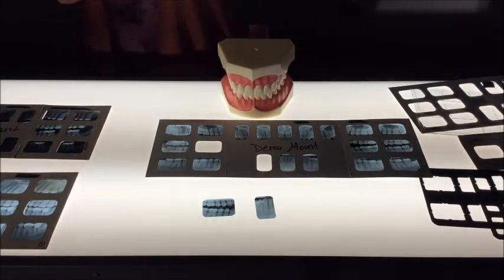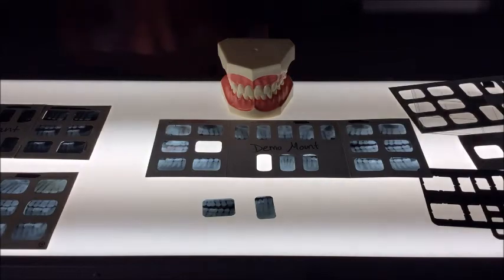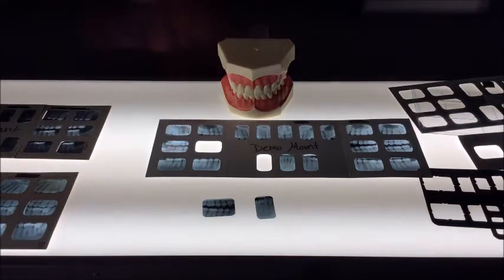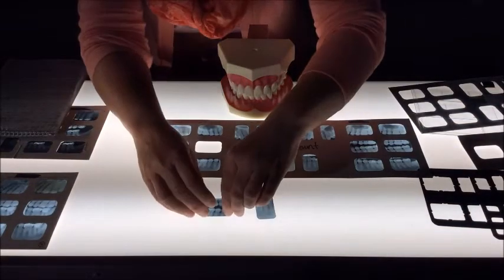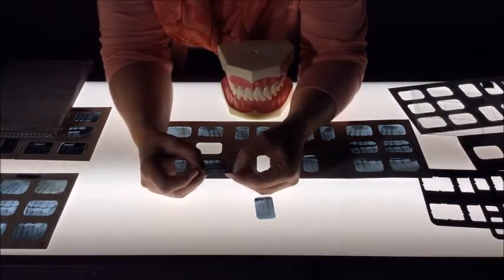The type that we use here at the dental health programs is known as labial mounting. This type of mounting is one in which the identification dot is convex. It feels like a pimple.